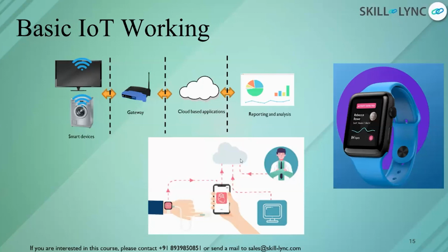So in real time, it should be 24/7 monitoring, and there should not be any delay in sending the data from the watch to the mobile phone. There should be no jitter or latency, guys. The jitter time should practically be zero, because it is healthcare data related to the lives of patients. So it should be very, very minimal. Another thing to consider is that if there is more noise, you are sending less information and more noise. So if you have filters and internal processing to filter it, that is a great deal. But this is very difficult, and many engineers are putting their brains into it, guys.